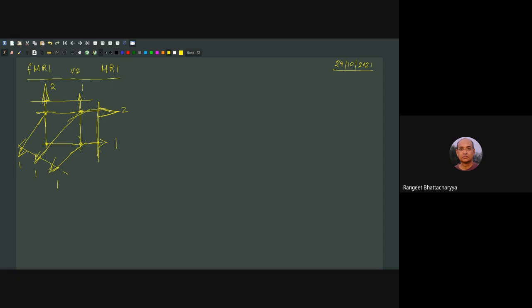In the second case, you have one here, so both the intersections don't have a spin, only one of them. These two must have something, but along this line, it tells you either this one or this one. One of the intersections has some spins.